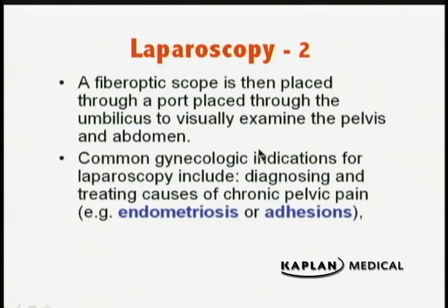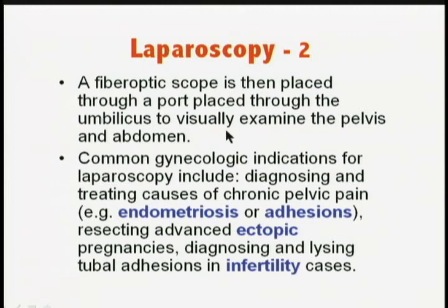This is used for general surgery for removing organs such as the gallbladder. In gynecology, we will use it for both diagnosing and treating causes of chronic pelvic pain. We'll talk about this at some length. Endometriosis, adhesions from chronic PID. If you have an advanced ectopic pregnancy, you can remove that using a laparoscopy. And if there are adhesions of the tube, of the fimbria with infertility, you can use laparoscopy as well.